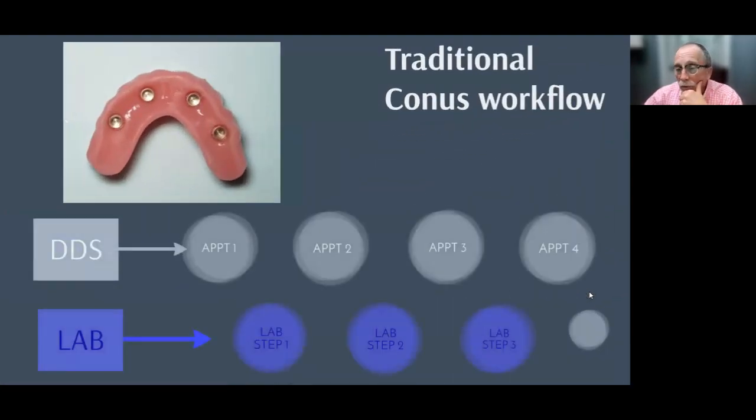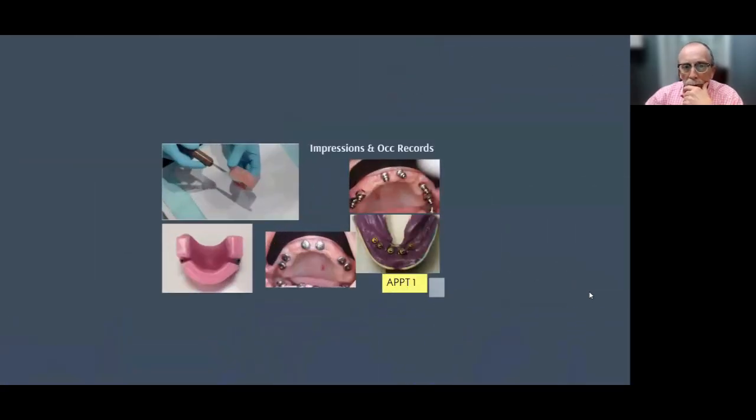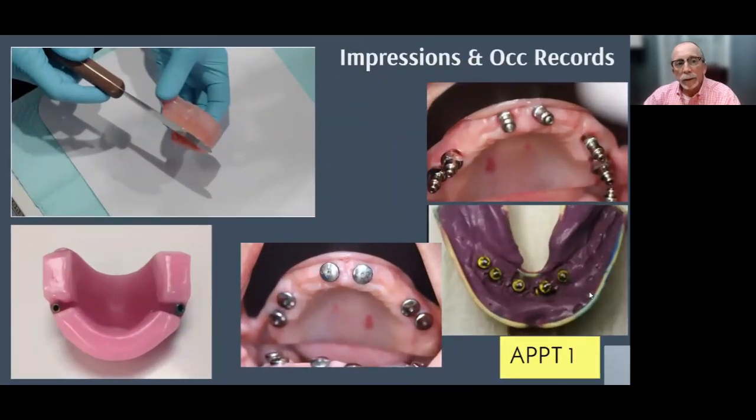So traditionally is how we started, right? No digital, other than getting the abutments made. And we could do it for the most part in 4 appointments. The first appointment is typical: let's take some records. The impressions are taken with the implant impression post. We're going to get a bite, all those things that we do, to move forward.